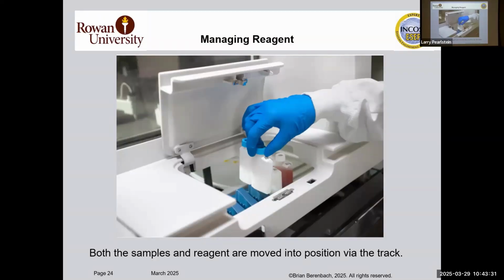Do you see that? Now, the nice thing about that is I can plug in more modules. I can take another assembly and add it on, and then add another one after that, and another one after that. After all, it's a train. And they will plug in, and I'll show you what a big one and a little one look like.